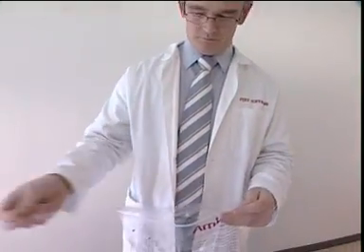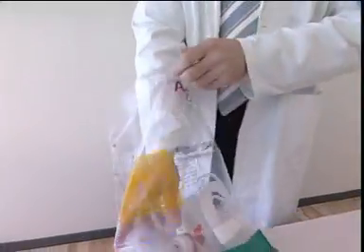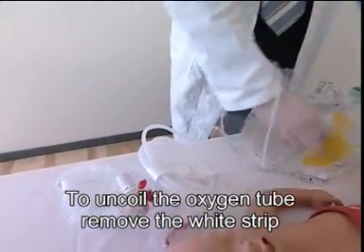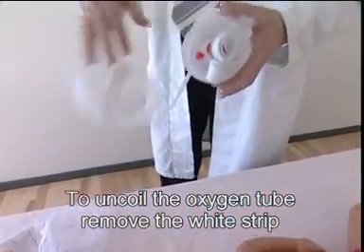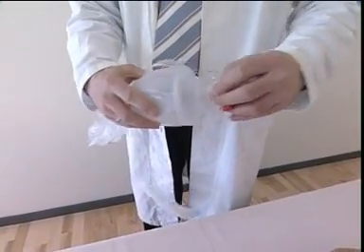To open the bag, pull the strip at the top of the bag and take the SPUR II out. If the SPUR II is packed in a compressed state, unfold the SPUR II by pulling on the patient valve and the inlet valve. Do not pull the reservoir bag. Tearing may occur.